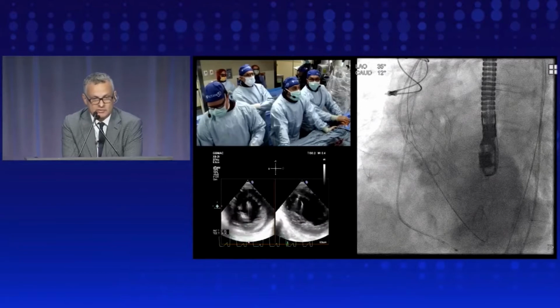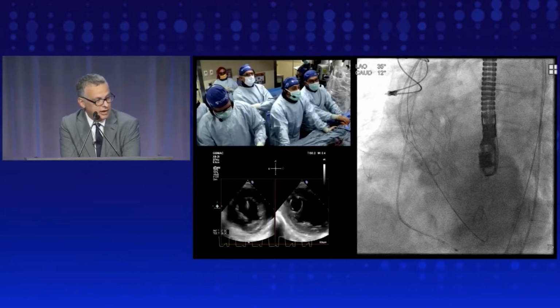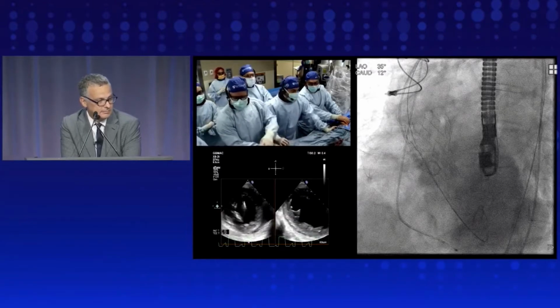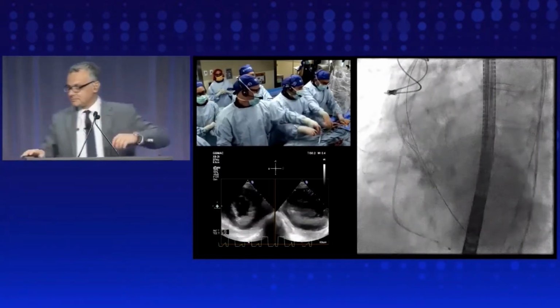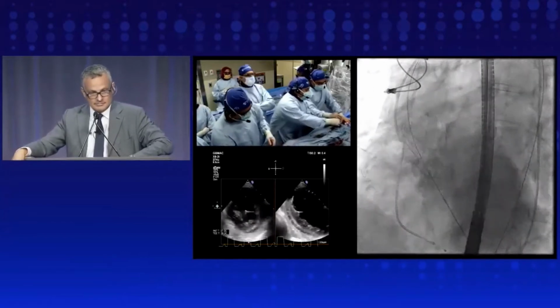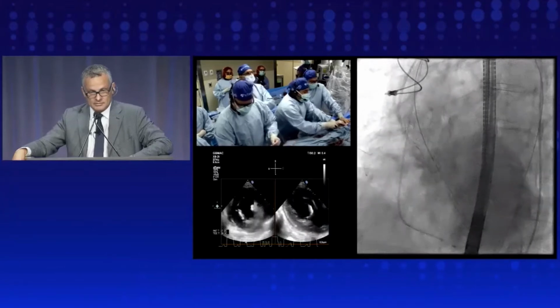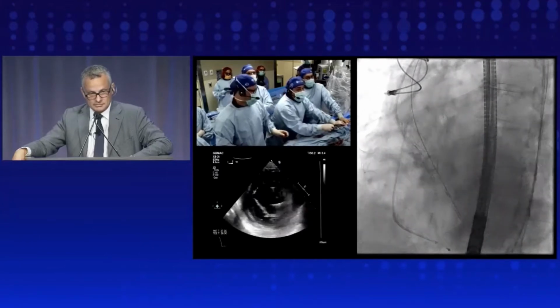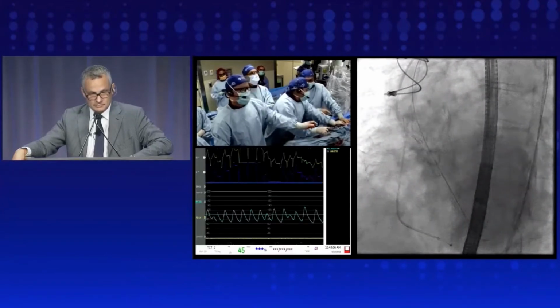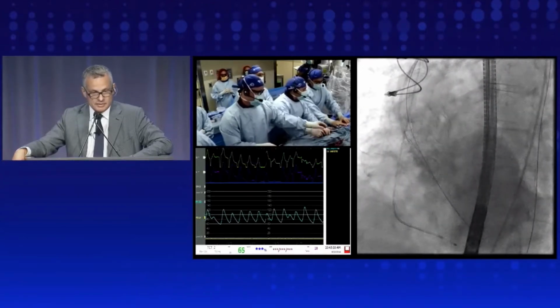We are all a bit stressed. But the heart looks very good. I mean, Maurice, what do you think? I think it looks pretty good. There may be some regional changes, so we have to pay a little attention to each part of the wall, but it looks good. Right now it's diastolic 60, which is great, and we're still pacing, I think. No. So diastolic pressure is excellent.